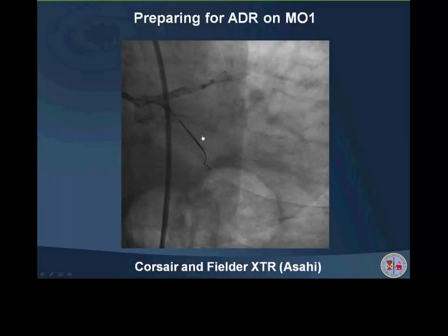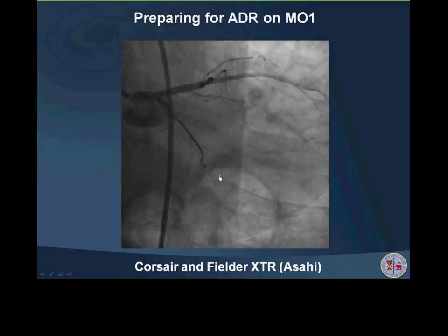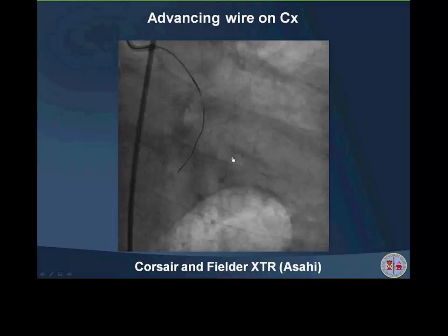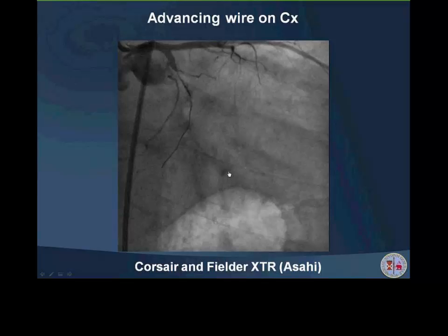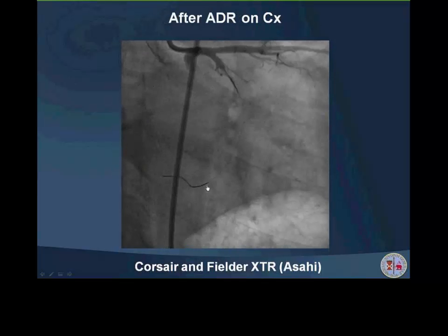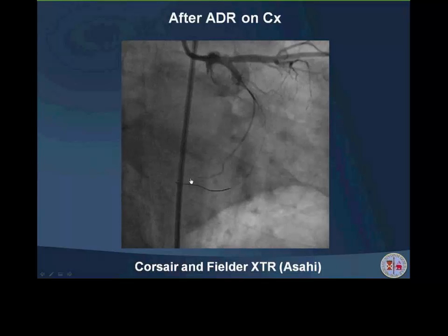And of course at that stage you have to put pressure. You can see the pressure because there is some disengagement from the guiding, and putting the pressure allows you to re-enter the more distal part of the artery. And this works, as you can see, on some branch here. And then it works in a way that basically it seems to be recanalized, of course, the main circumflex lesion.